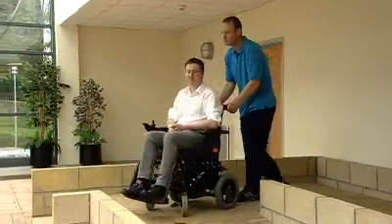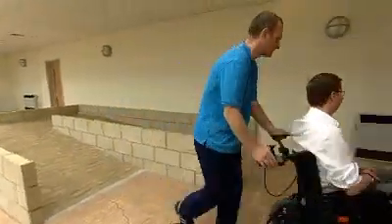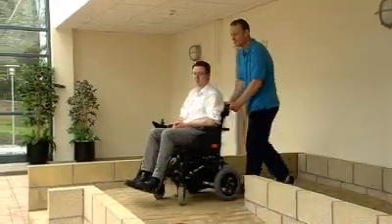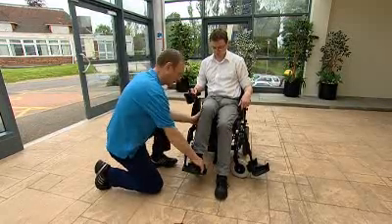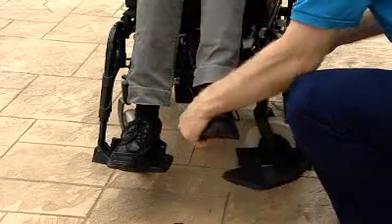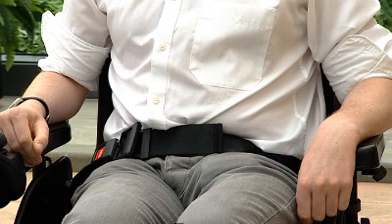You should be aware of different surfaces and slopes before using the wheelchair for the first time. A demonstration on how to negotiate surfaces, slopes and curbs will be provided later in the video. You should always keep yourself safe and be aware of other people around you. The foot plates should be clicked into place. The powered wheelchair will come with a lap strap fitted as standard and can be used if required.